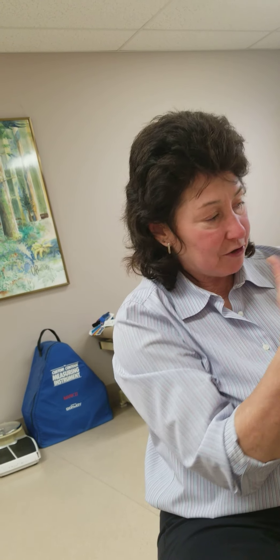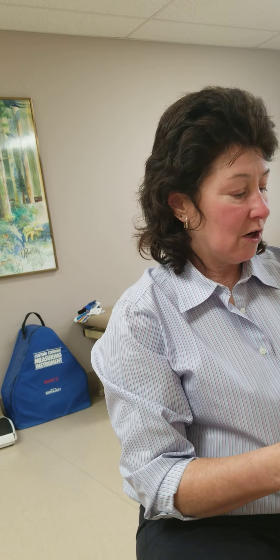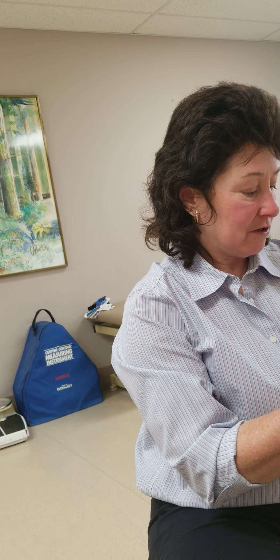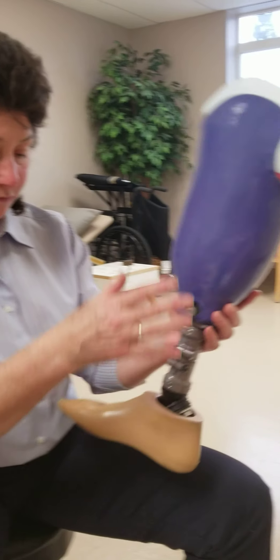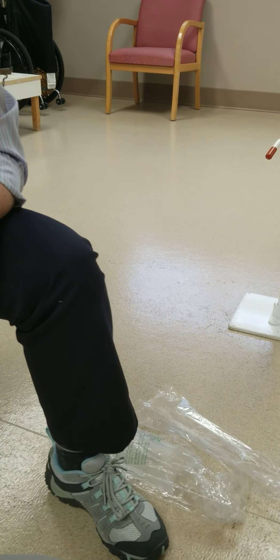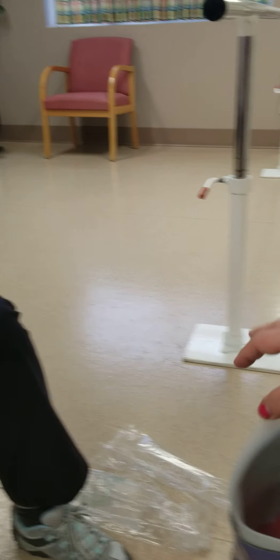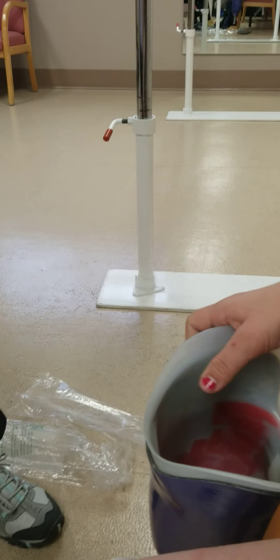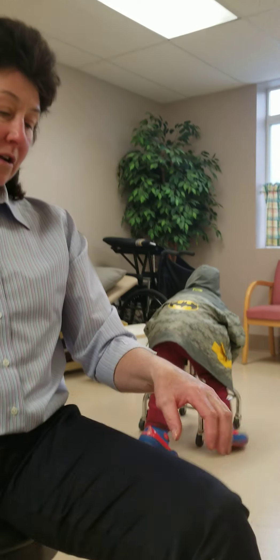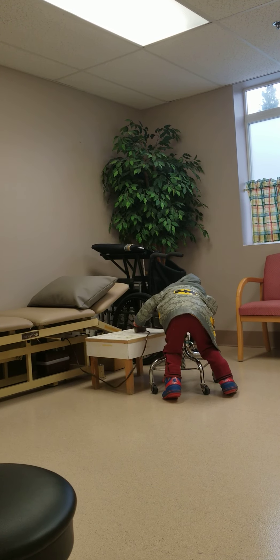We don't typically reuse the lock, so it'll be a new lock — that way if something happens and you need to go back to the old one, I haven't torn it all apart. So basically just the foot is being reused; everything from here up will be new. The foot has been working great in terms of weight and flexibility. We tried a few different ones — one was too bendy, which made me timid, and one was too heavy. So it's the Triage foot — a very nice, lightweight carbon fiber foot.